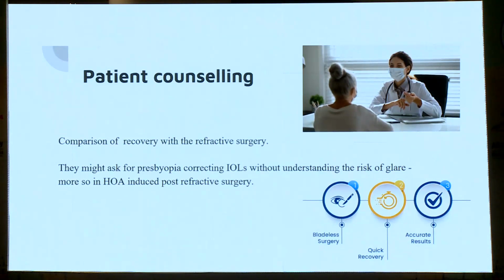Also, patients who undergo refractive surgery might want a glass-free life because they've been leading a glass-free life, so they might ask you for presbyopia-correcting IOLs. So it is important that you educate the patients and tell them about the chance of glare, especially in those who have been induced high-order aberrations post-refractive surgery.